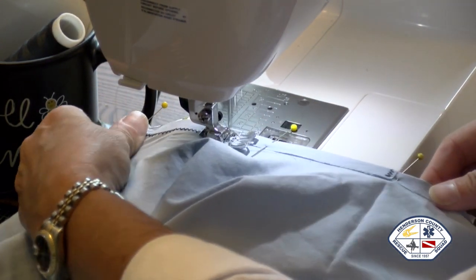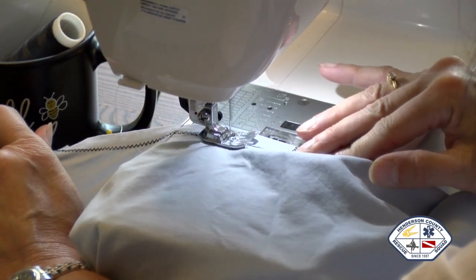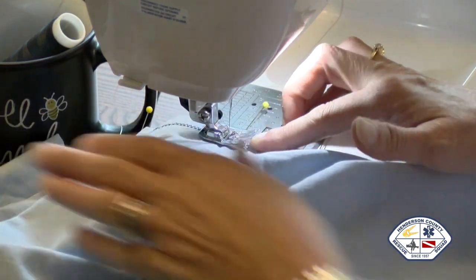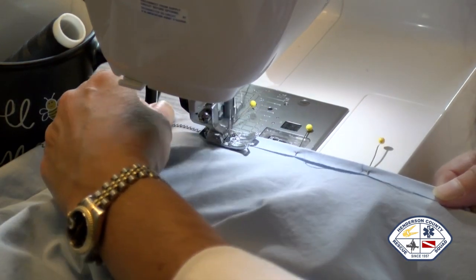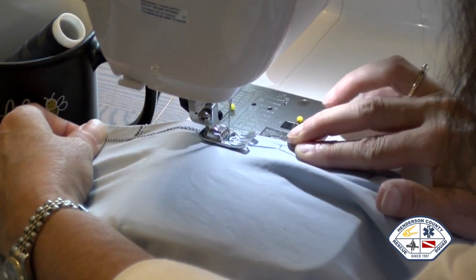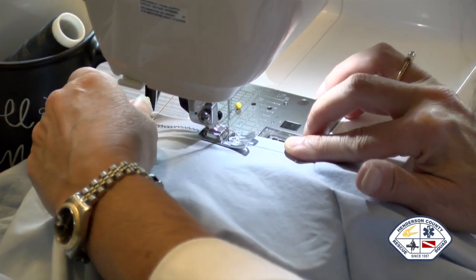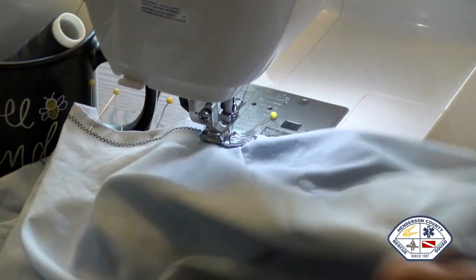Now this zigzag you're seeing right here is where I put two pieces together of this binding that I cut off at the edge of the sheet. And I'm zigzagging because it is not a finished edge. So in order to make it a little bit more durable in the mass number of washes that it will take, zigzag should keep any fraying down to a minimal.